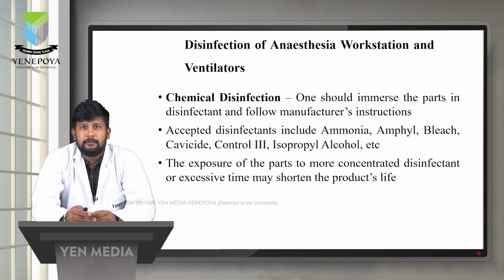Chemical disinfection. One should immerse the parts in the disinfectant and follow manufacturer's instructions. Accepted disinfectants include ammonia, bleach, Cavicide, isopropyl alcohol, etc. The exposure of the parts to more concentrated disinfectant or excessive time may shorten the product's life.